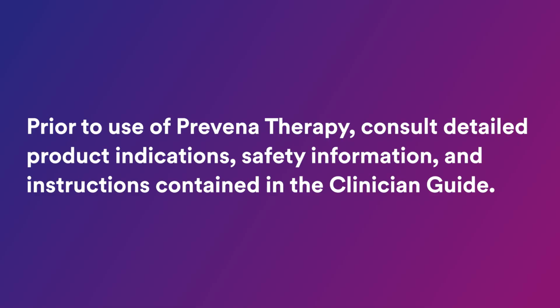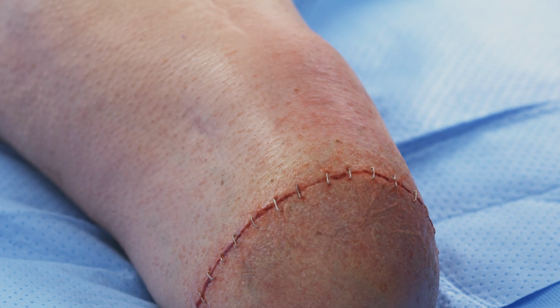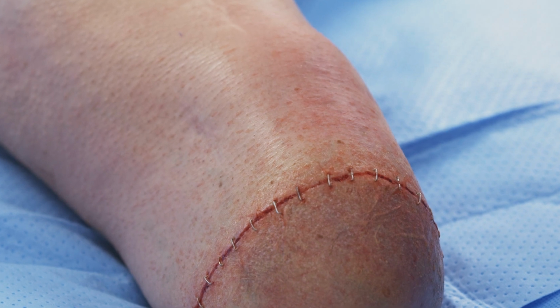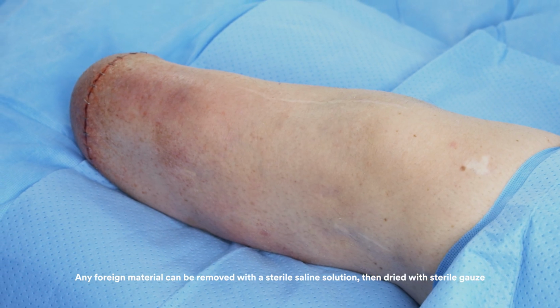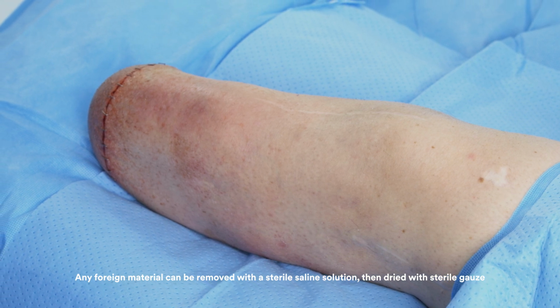Prior to use of Prevena therapy, consult detailed product indications, safety information, and instructions contained in the clinician guide. You'll notice that the hair has been preoperatively clipped to accommodate the area where the dressing will be applied. It is important that this area is clean and completely dry before application to ensure a tight seal.